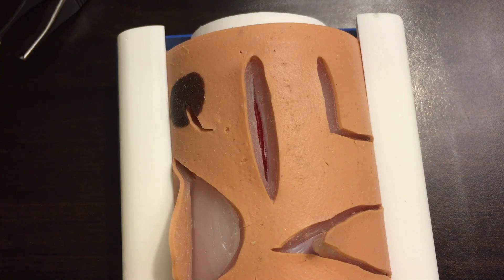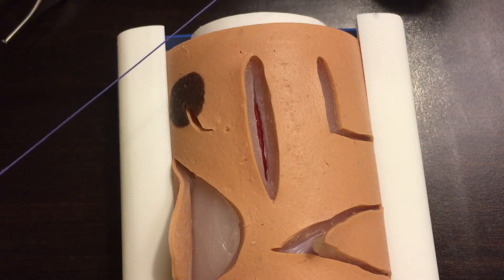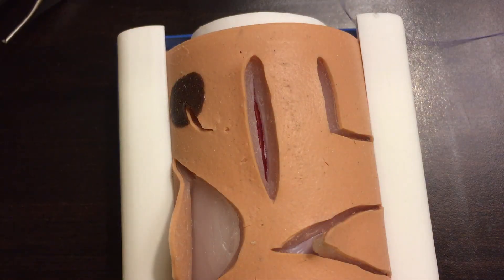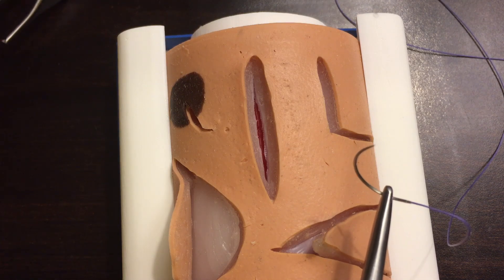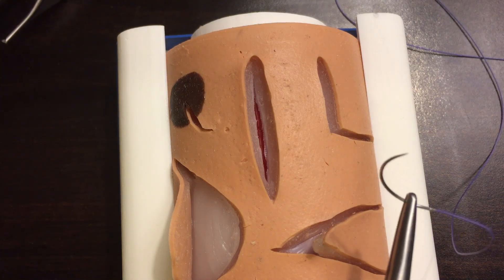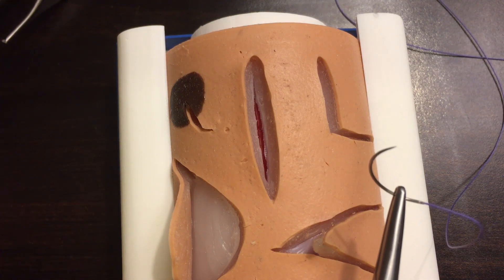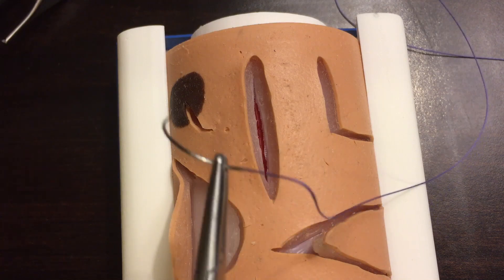Hi everyone. I wanted to show you how to throw a deep vicryl suture, or any other kind of absorbable suture that you might be using in a deeper skin closure, especially in the operating room. Vicryl is an absorbable suture — in my experience in neurosurgery we're using it to close the deeper layers of tissue, because you can't just close the skin. If your incision is deep through fascia and through a lot of subcutaneous or adipose tissue, you need to help pull that together.